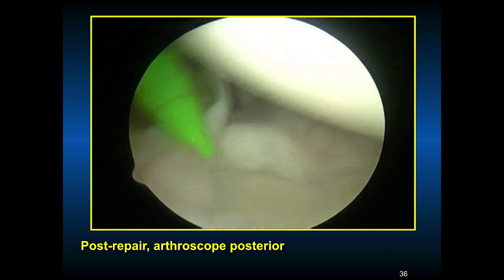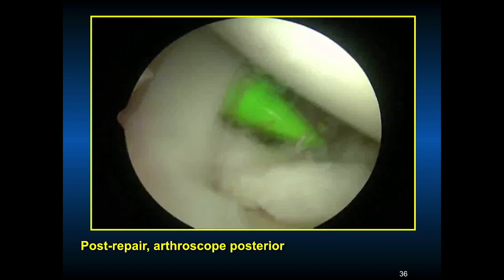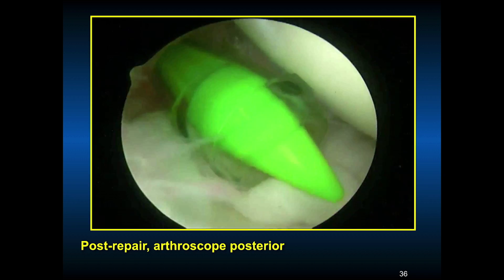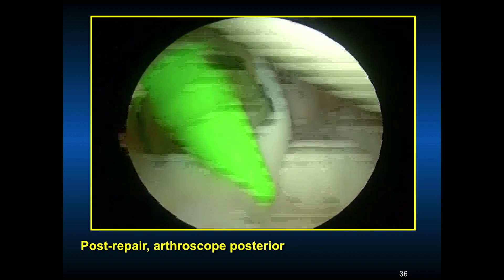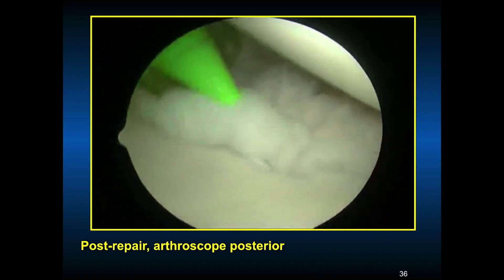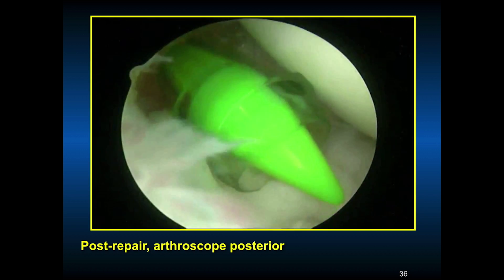This is after the repair. Here's our biceps tendon up here — this is after we've repaired using six sutures, four anteriorly. We used to repair more of the posterior superior labrum as well as the anterior inferior labrum. You can see he has a pretty much 360-degree labral repair: anterior superior, anterior inferior, and posterior superior. The biceps tendon looks pretty good in this 24-year-old. You don't want to over-constrain these patients, so you want to move them early but not allow them to return to contact sports or boxing for at least six months if not longer.